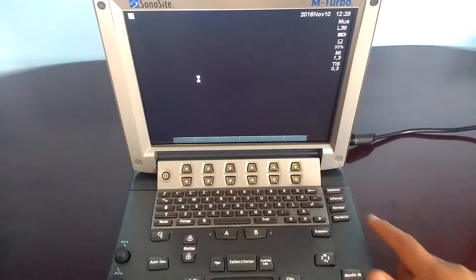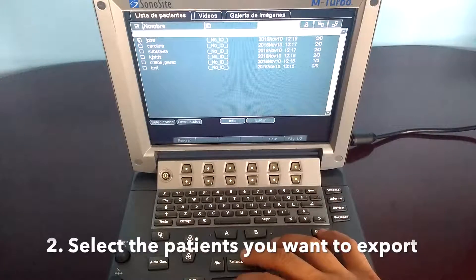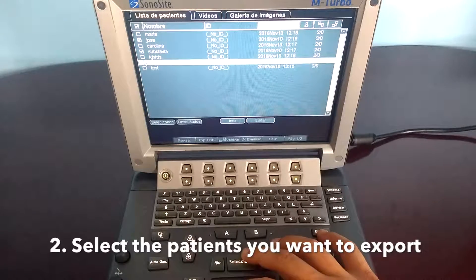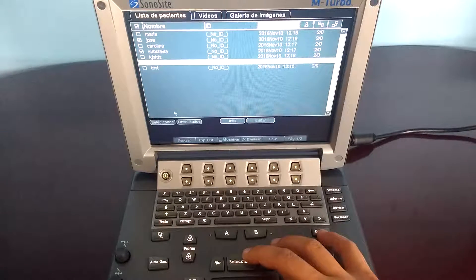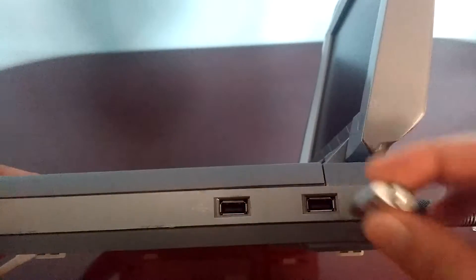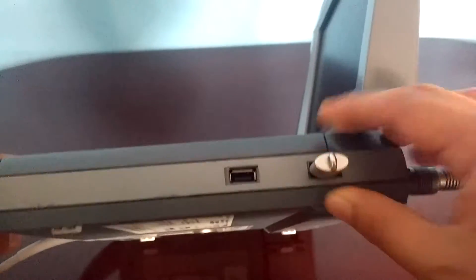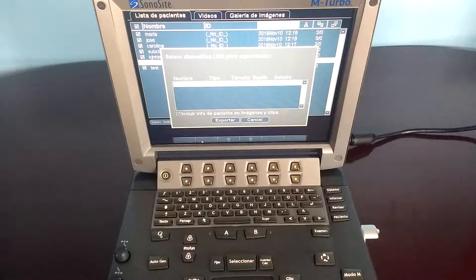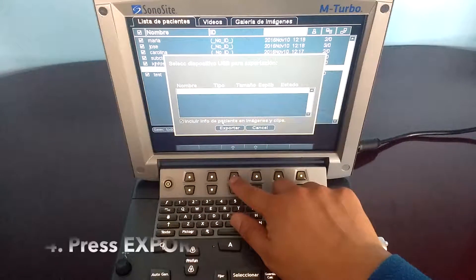Press the review key and select the patients you want to export to the USB. You can select each one individually, or select all with the 'Select All' button. Plug in the USB memory stick, press the export USB button, and press export.